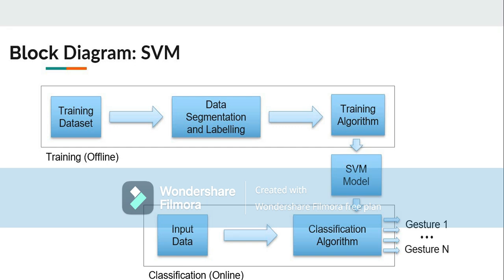We get to the classification, where we input our data, which basically means we input our image which is to be checked for whether it has a tumor or not, and using the trained model, it classifies whether it is or not.